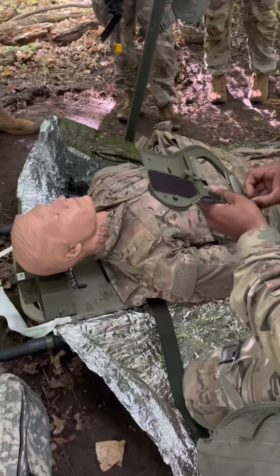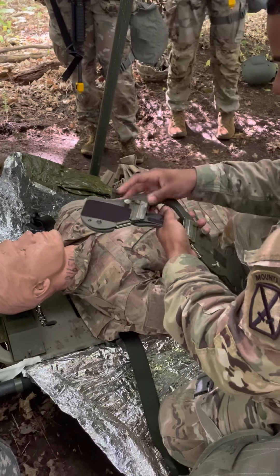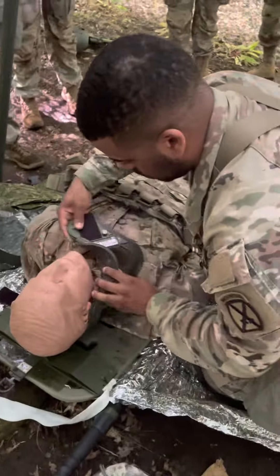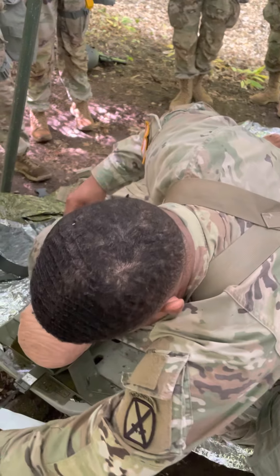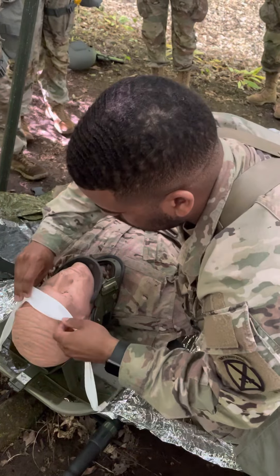I'm going to make the adjustments like so, and the setting was the smallest one. Did you measure his neck? Yes, I went like this. And then we're going to pop this — stabilize his head, like so.